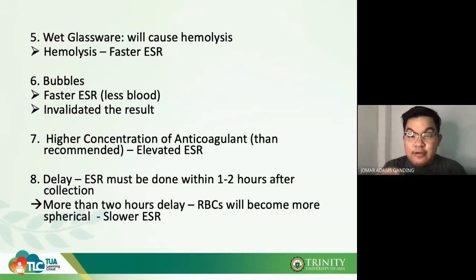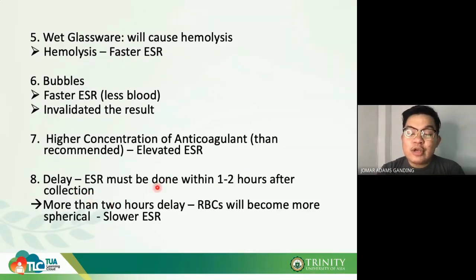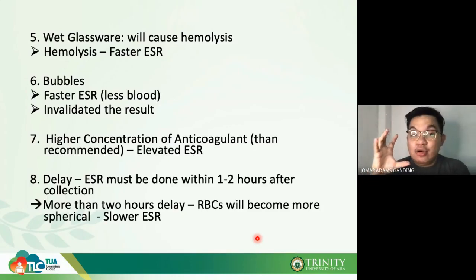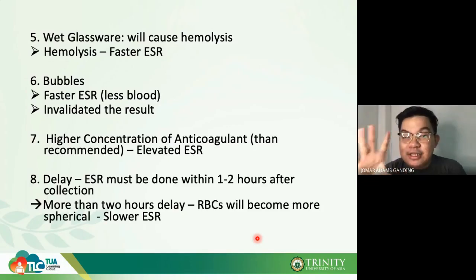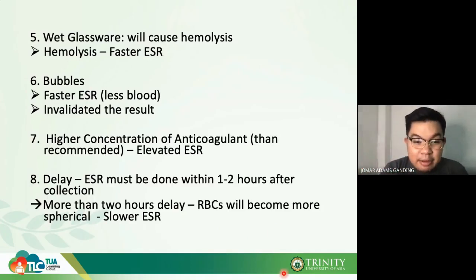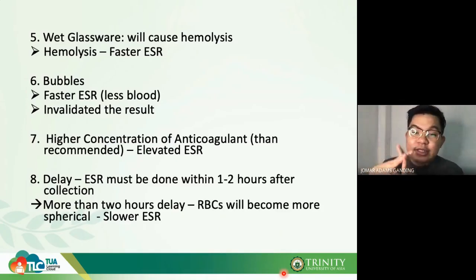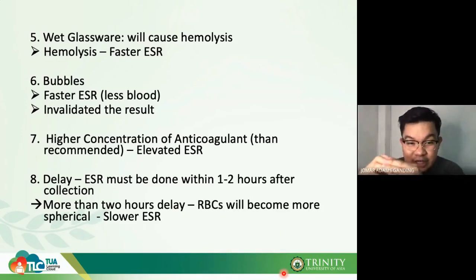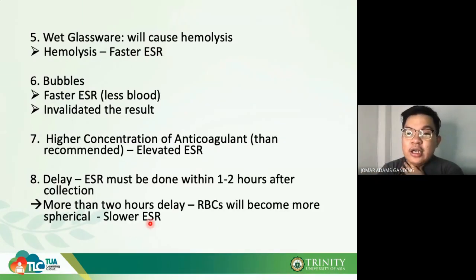Delay in performing ESR — for example, more than two hours after collection — causes RBCs to swell, leading to spherocyte formation (poikilocytosis), which results in slower ESR. All of these — higher anticoagulant concentration, wet glassware, and bubbles — are associated with faster ESR, while delay causes slower ESR.